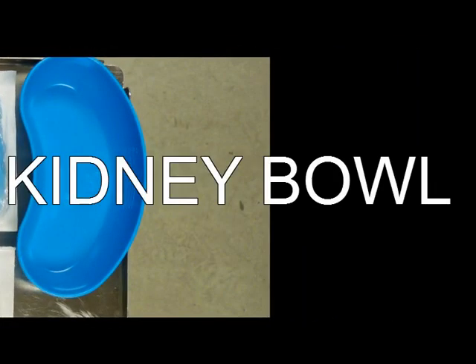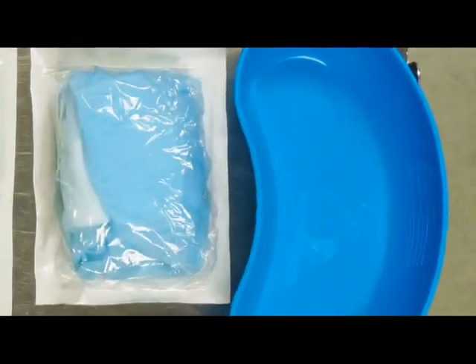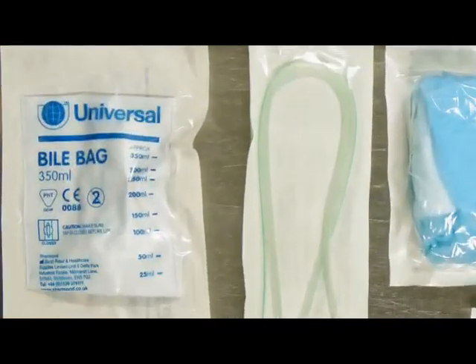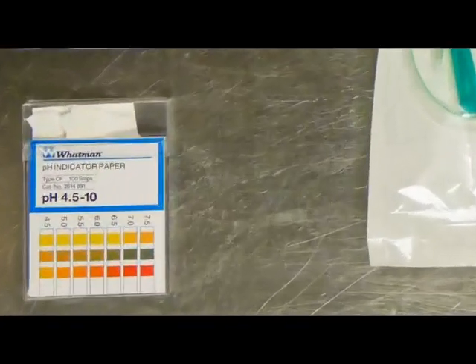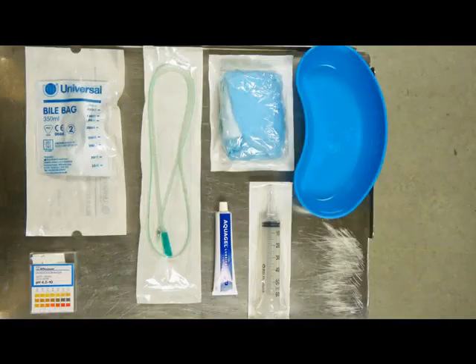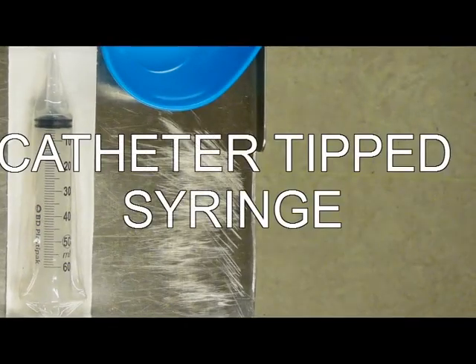The following items are required: kidney bowl, dressing pack, NG tube, a bio bag, pH indicator strips, lubricant, and a catheter tip syringe.